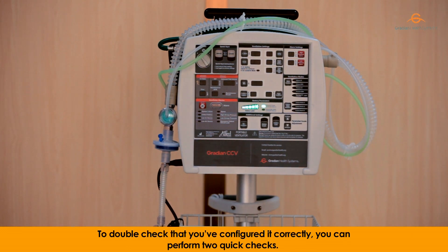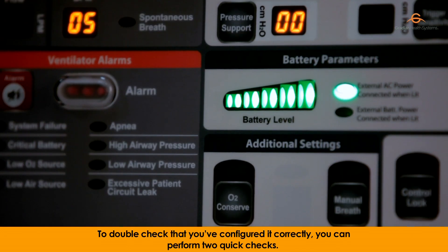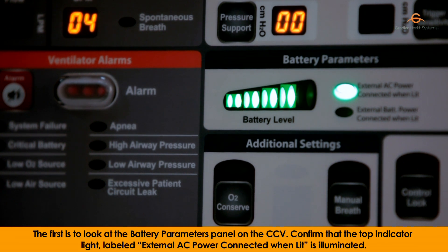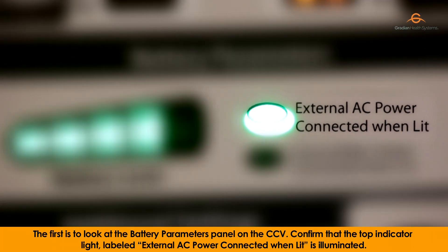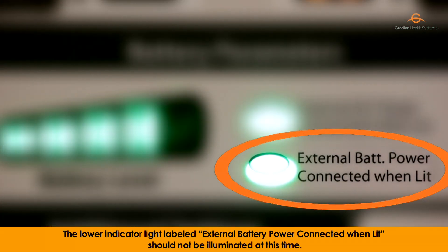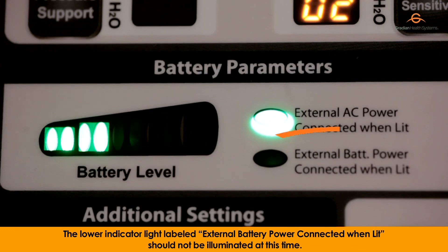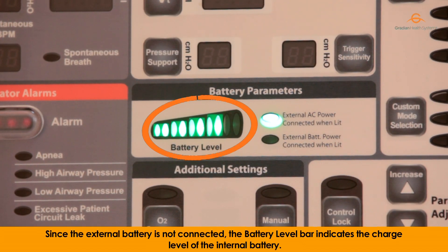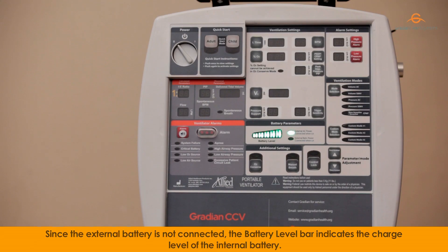To double check that you've configured it correctly, you can perform two quick checks. The first is to look at the battery parameters panel on the CCV. Confirm that the top indicator light labeled 'external AC power connected when lit' is illuminated. The lower indicator light labeled 'external battery power connected when lit' should not be illuminated at this time. Since the external battery is not connected, the battery level bar indicates the charge level of the internal battery.